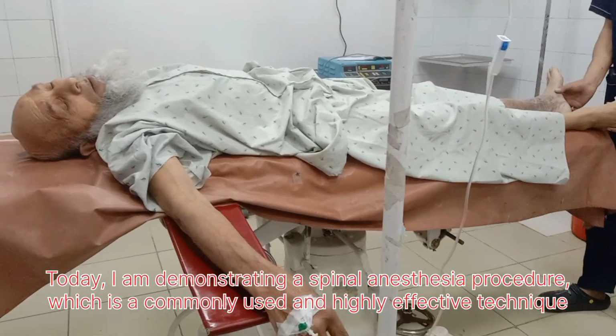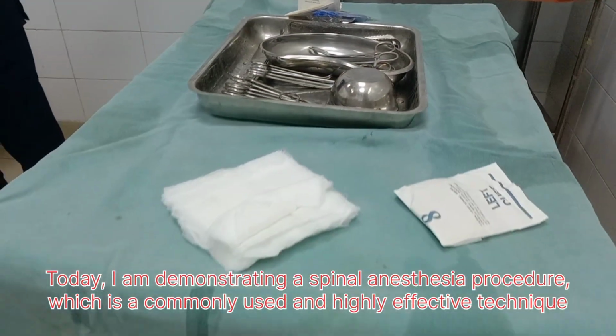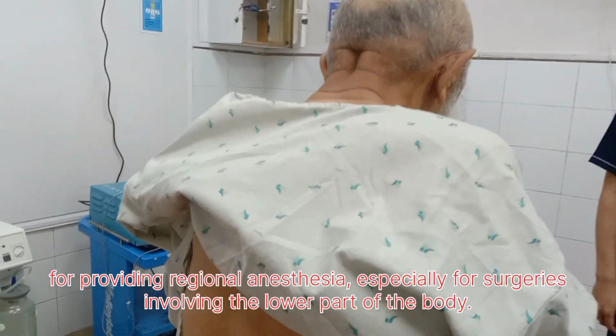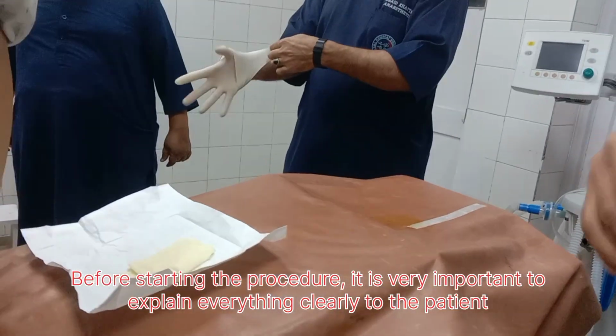Today, I am demonstrating a spinal anesthesia procedure, which is a commonly used and highly effective technique for providing regional anesthesia, especially for surgeries involving the lower part of the body. Before starting the procedure, it is very important to explain everything clearly to the patient and obtain informed consent.